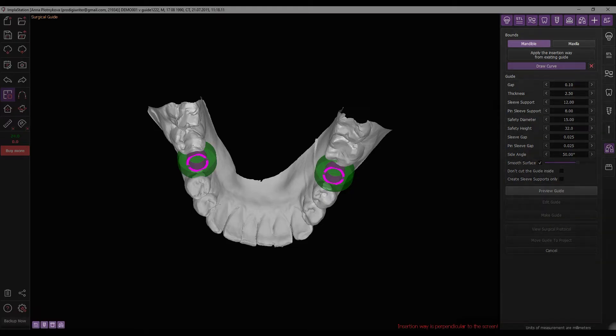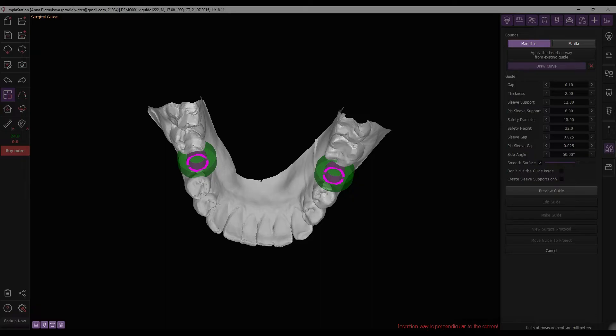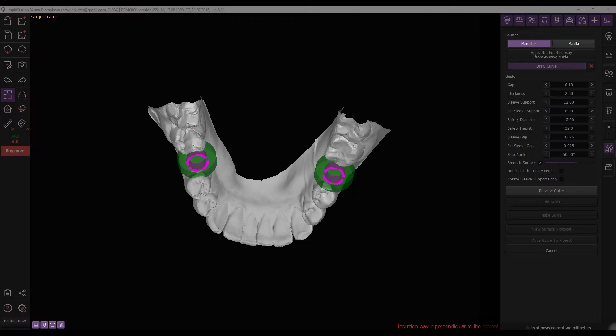First, check and, if required, correct the JAW type using the dedicated controls.